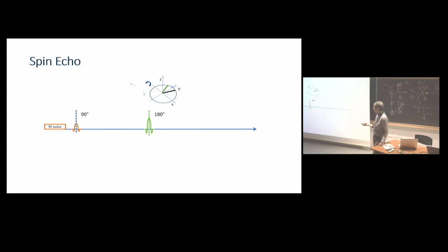Both these techniques are based on the spin echo sequence. So you see here, now the 180-degree pulse is no longer before the excitation pulse. This is the excitation pulse. The 180-degree pulse comes after, and we don't call it an inversion pulse anymore. We call it a refocusing pulse. So it's the same number, but it has a completely different meaning because it now acts in the transverse plane, no longer in the longitudinal plane as in the inversion recovery technique.